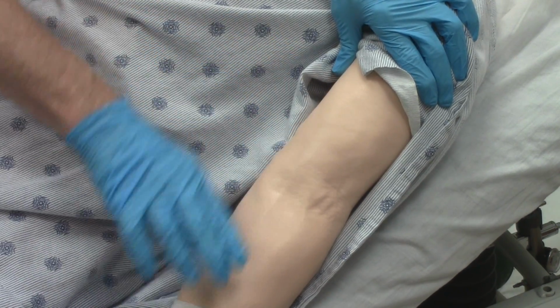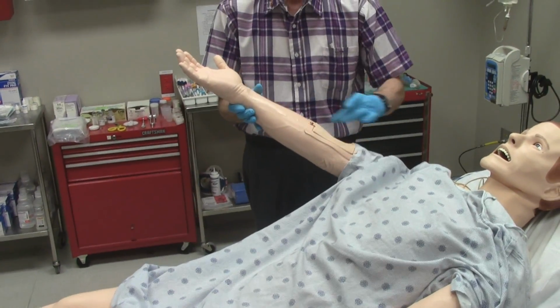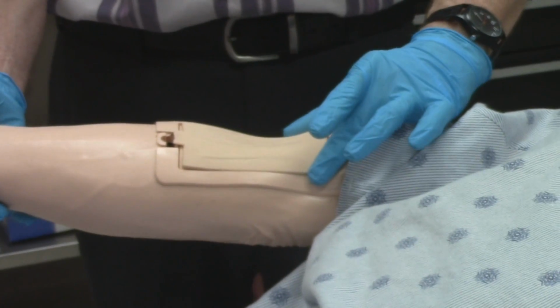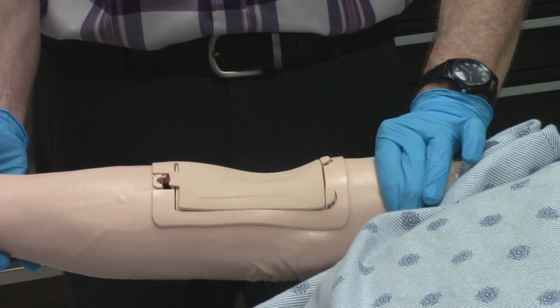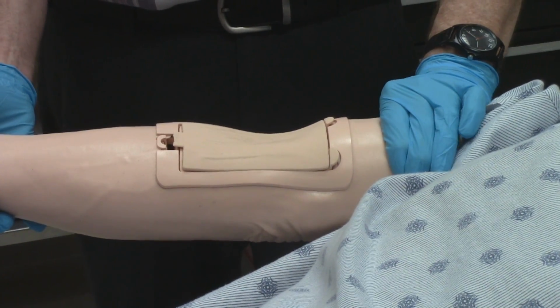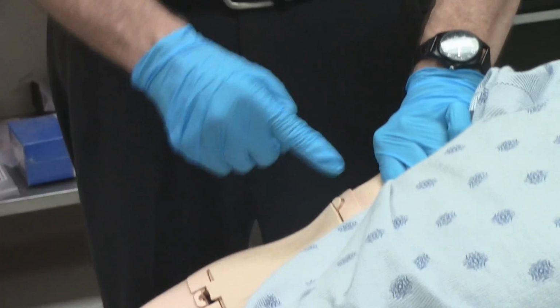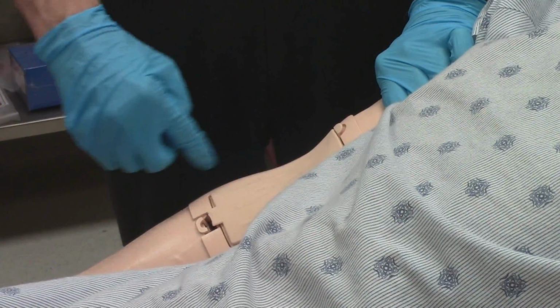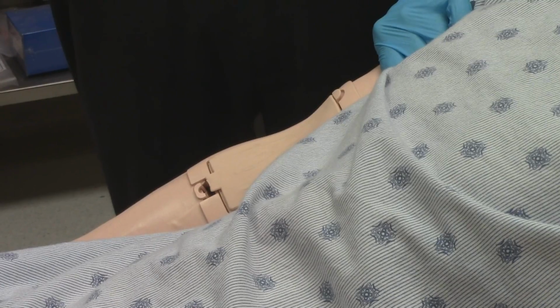The reason the brachial pulse is located in the left arm only is because in the right arm we have this IV pad. On the SimMan Essential, this is the only location where you can start an IV. You can place a tourniquet on the mannequin's arm to help the veins become more obvious. You notice as I squeeze down the upper arm, the veins are distending slightly. As with all other sticks we perform on the mannequin, we will use 20 gauge or smaller IV catheters to stick this pad. No large needles. So 20, 22, 24 small needles so we don't damage the plastic.